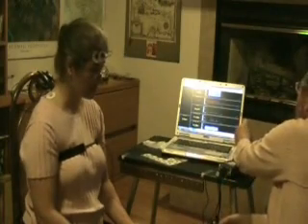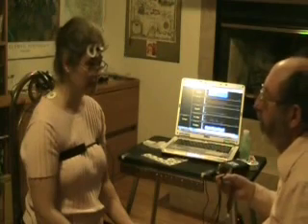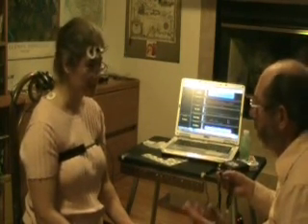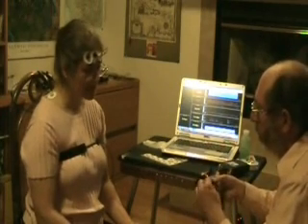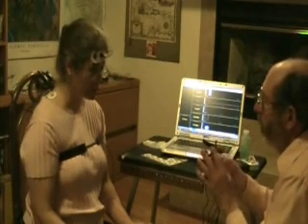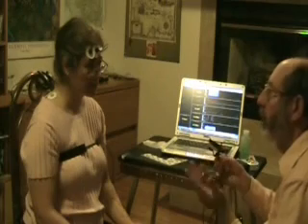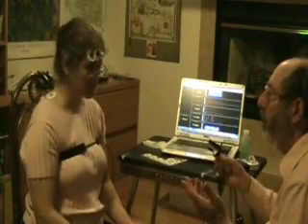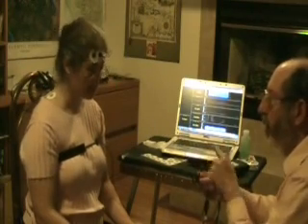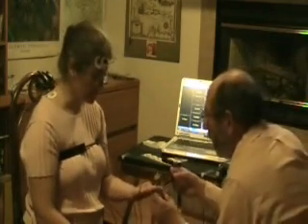The reason we care about sweat is that when you get nervous or upset, you sweat more. As you relax, you sweat a little bit less. The reason we're able to pick up anything with these little sensors is that your sweat is mostly salt water, which conducts electricity. The machine will send a tiny current from one sensor to the other. So it has to cross the salt water to pick it up. Okay, same hand? Yep, same hand.